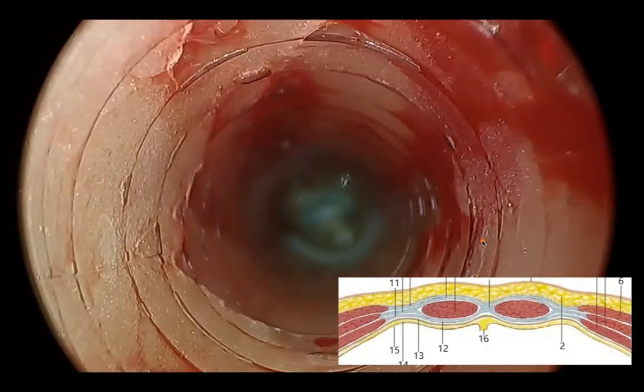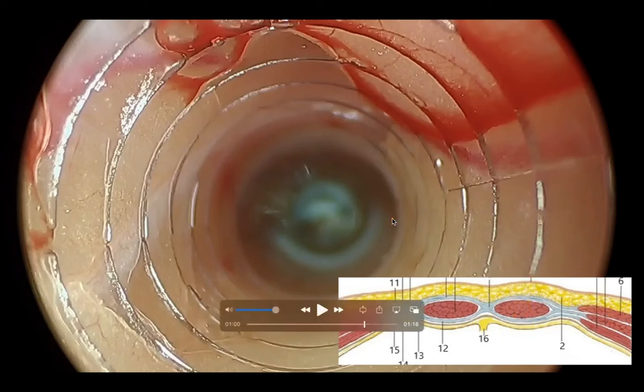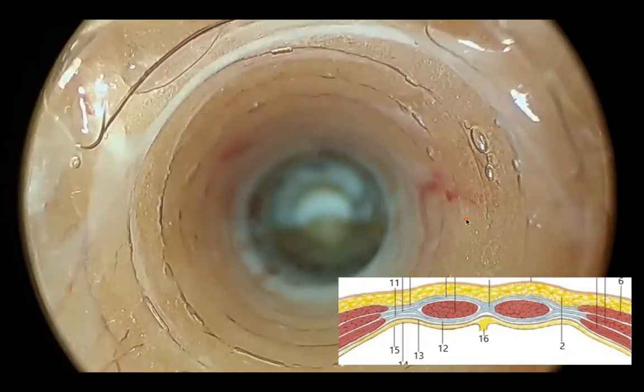This next view is useful because it's a view after a trocar has already been inserted, so you can see those layers — especially in the deeper aspect of the abdominal wall — that don't show up as well as you're actually forcing your way through. With the trocar in there stenting it open, we can get a good view of the posterior layers. Here we can see the yellow fatty layers of the subcutaneous tissue. The trocar is essentially all the way in right now — we're just looking at each level on the side as we pass our camera into the abdomen. You can see there's actually peritoneum overlaying the tip of the trocar that they'll need to push through at the very end.